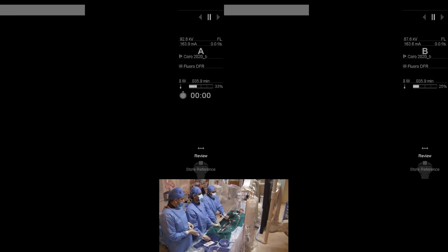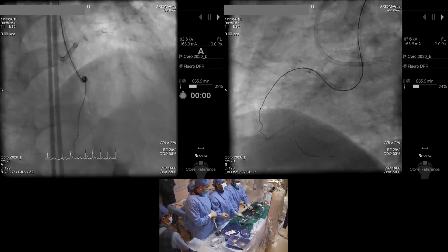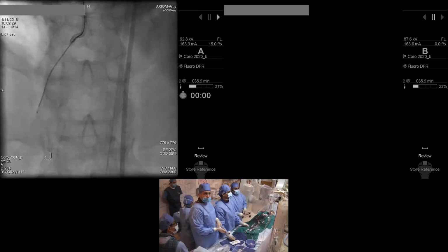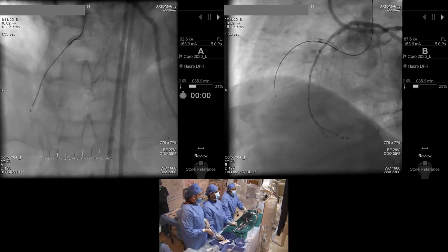So I will let you see where we are. All the time when I negotiate, my wire is going to a side branch, maybe the second RV branch, always in this place. This is the RV branch, as you see. In this place, I believe there is a big calcium burden, as we see in the CT and second CTO segment. So I agree with Dr. Owayed to have a more puncture wire, a penetrating wire, which is Gaia 3 or Conquest Pro.